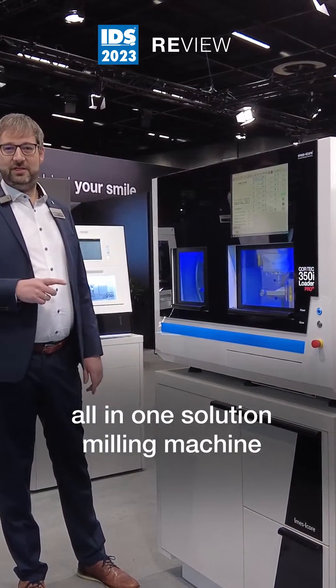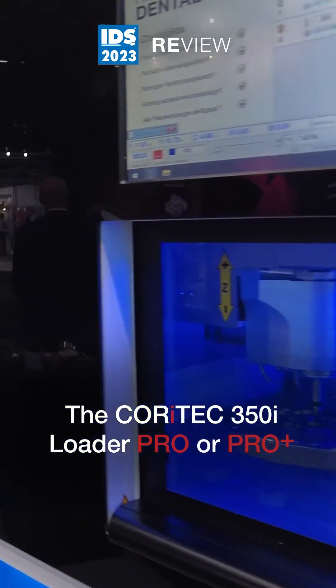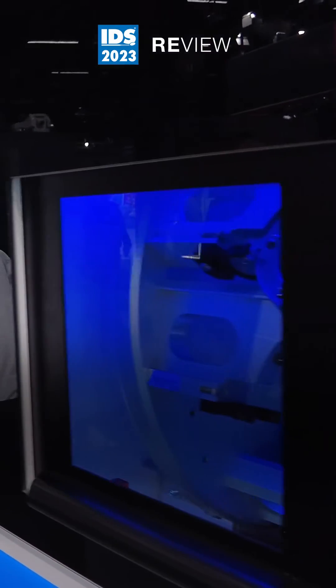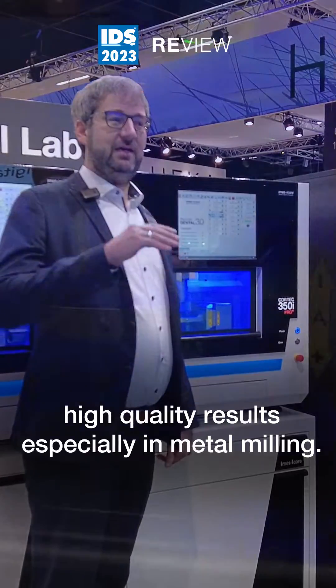Are you looking for the most sold all-in-one solution milling machine in the dental market? The Korytek 350i Loader Pro or ProPlus is what you need. The machine series is built on a granite base, which means it gives you really high quality results, especially in metal milling.